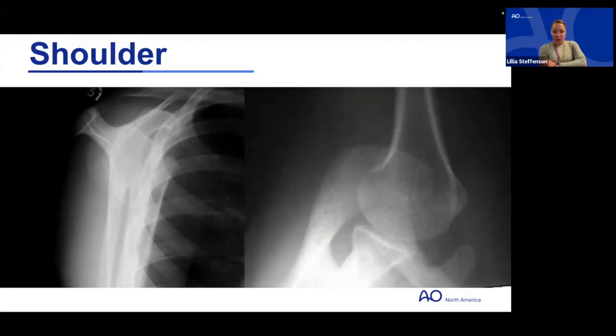I think a lot of the value of CT scans come from fracture patterns where you know there's a reasonable incidence of associated articular fracture, or that there might be extension to an articular surface that would change your implant choice or your approach to treat the fracture. A good example is a spiral distal third tibial shaft fracture that might have a very difficult to visualize extension to the posterior malleolus, or a proximal tibial shaft fracture where there's a questionable line that I really can't interpret on radiographs as to be a true fracture line extending to the joint surface that would change how I approach the injury.